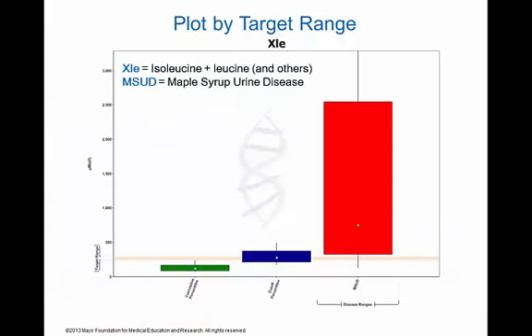A different analyte has been selected as a model to demonstrate the purpose of this tool. XLE is an abbreviation commonly used to indicate the mixture of two branched-chain amino acids that have the same molecular weight, isoleucine and leucine. In a testing mode that does not involve front-end chromatographic separation, isobaric compounds like these two and also other minor components are measured together.